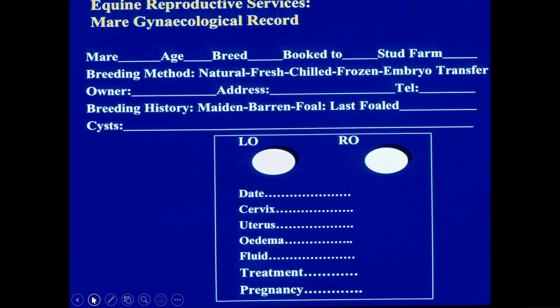Now, precisely what you put on it is going to be up to you. I, of course, put up the example we use, and it works well for us, but it's not saying this is what it has to be. It's whatever you think will work best for you. We have a little bit of a look at ours. You'll see, normally these boxes are replicated 6 times on each piece of paper, just for ease of understanding. And in this presentation, I've just highlighted the one box.